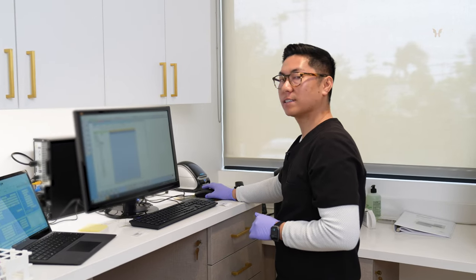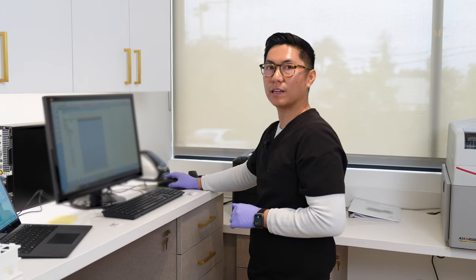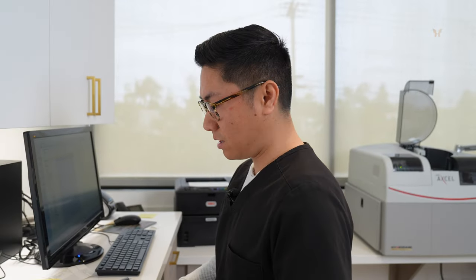Now that the testing's done, the results are sent over to the computer. All you have to do is click accept, and it'll print out. We'll have one of the surgeons — or the performing surgeon — review it. And that's it.